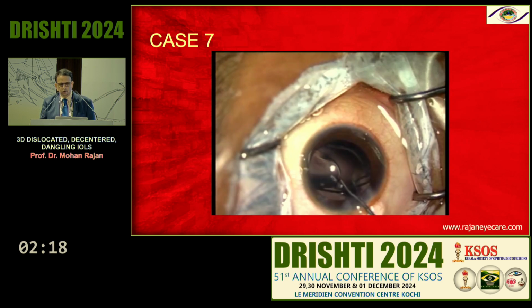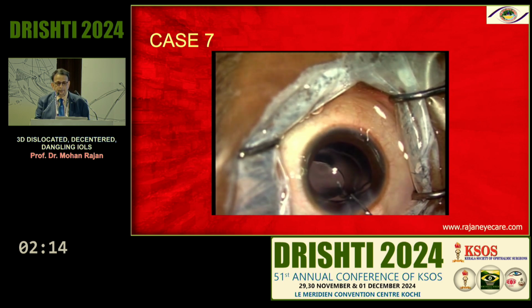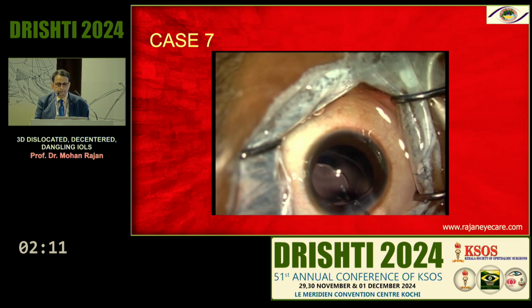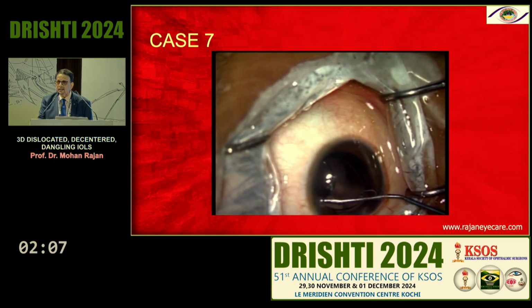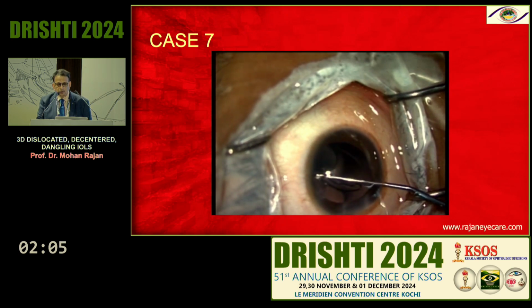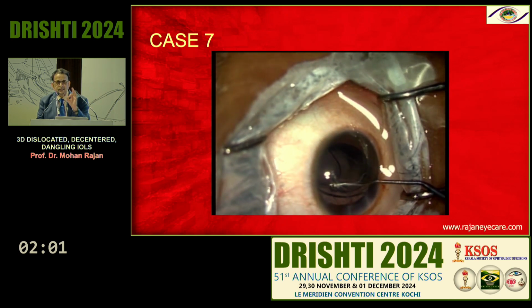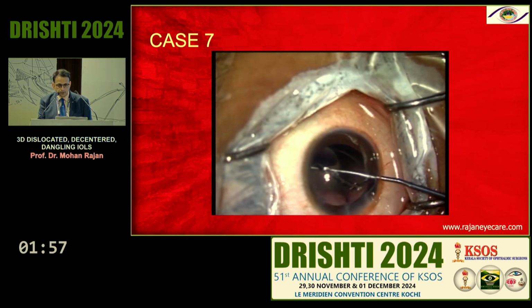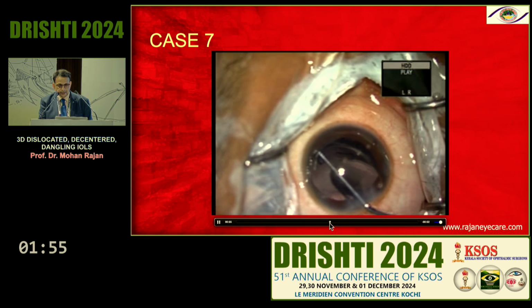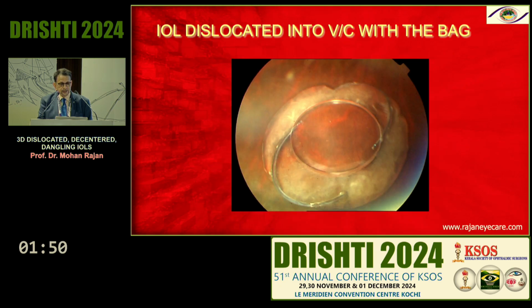This is a young patient, traumatic cataract, and you can see here the PC opened up, the lens started going into the vitreous. Immediately what I did was what is called the ALL, anterior assisted levitation. So I go through the side port and bring that lens up, and this is a Supraphob lens. It does not have thick haptics like the Alcon SA60. So I just brought the lens up and then put this lens into the sulcus, and the patient is doing well.